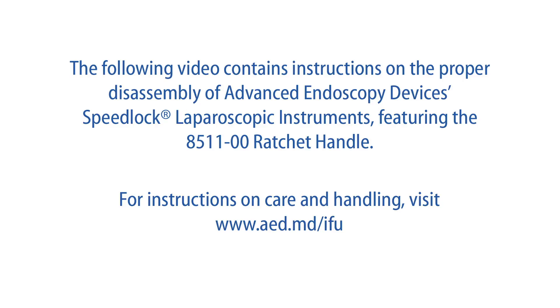The following video contains instructions on the proper disassembly of Advanced Endoscopy Devices Speedlock Laparoscopic Instruments featuring the 8511-00 ratchet handle. For instructions on care and handling, visit www.aed.md/ifu.